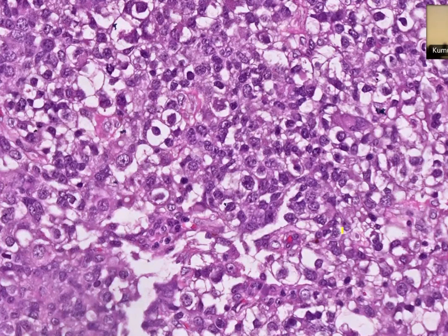Sir, few of the cells have round nuclei and indistinct eosinophilic cytoplasm, whereas few of the cells have round nuclei with clear cell changes. More or less the nuclei are similar type, some showing conspicuous nucleoli, not macronucleoli. There is clearing and few cells show eosinophilic cytoplasm.